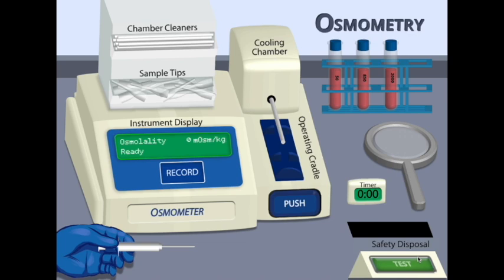After calibrating the osmometer, select the Test button to evaluate patient samples. The Restart button provides you with different samples. Make sure that you do not select this button until you have completed your evaluation of the current sample.